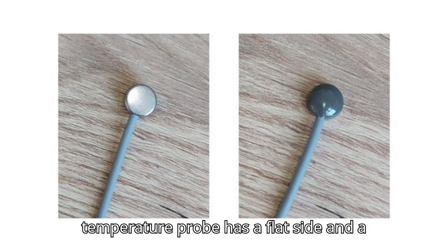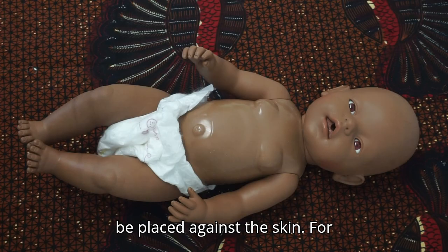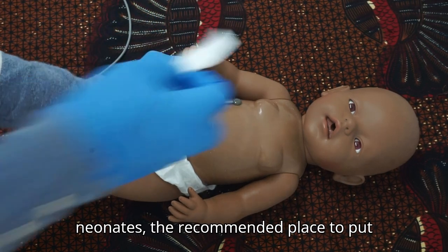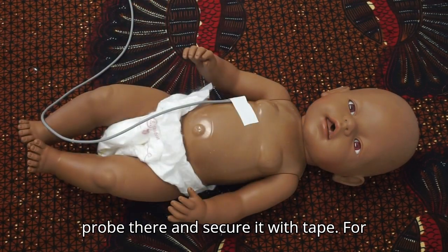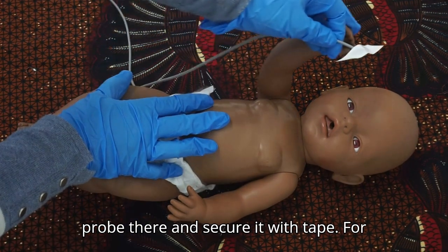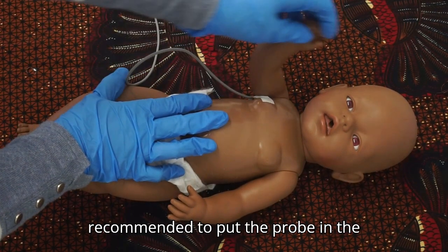The temperature probe has a flat side and a rounded side. The flat side has to be placed against the skin. For neonates, the recommended place to put the probe is on the abdomen. Place the probe there and secure it with tape. For pediatric and adult patients, it is recommended to put the probe in the armpit.